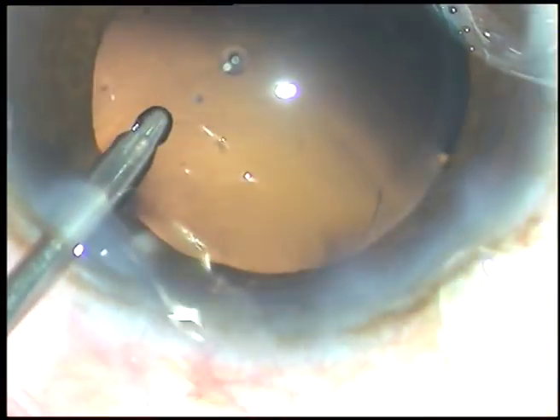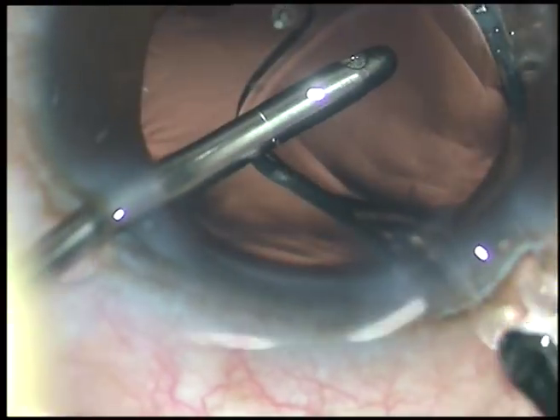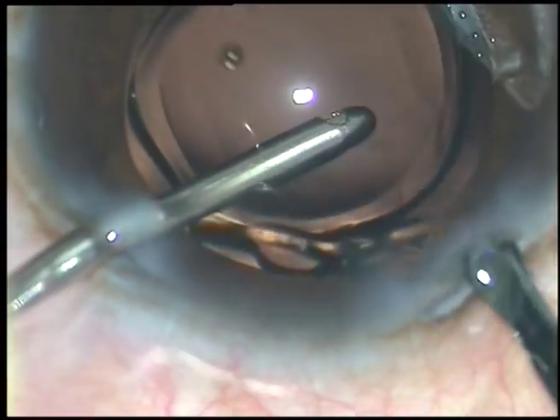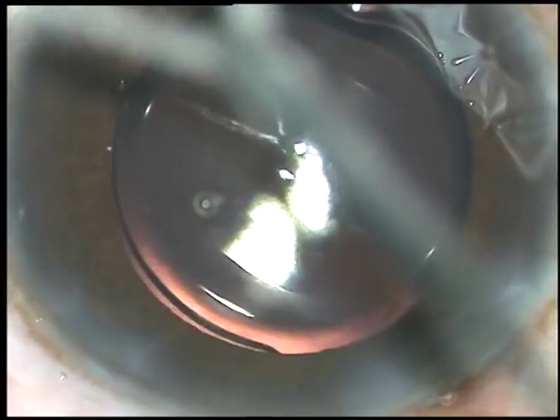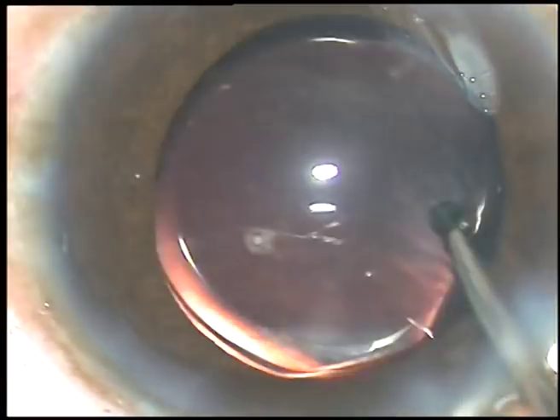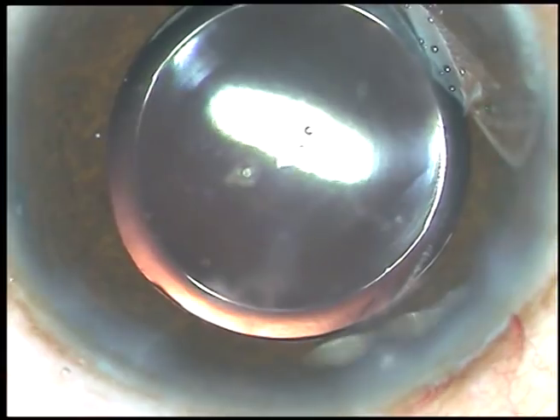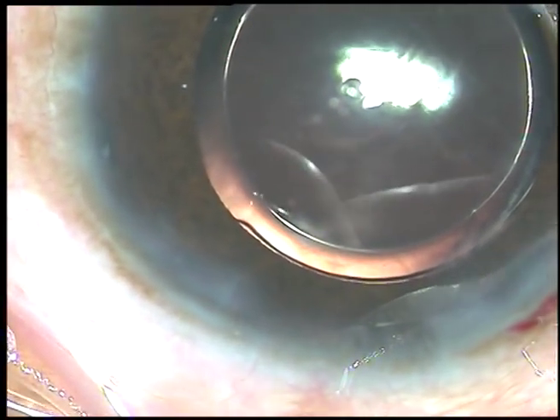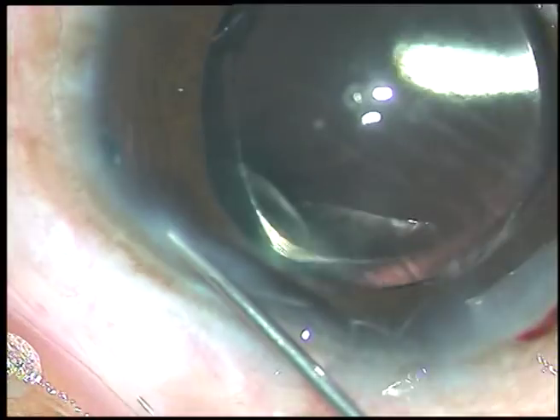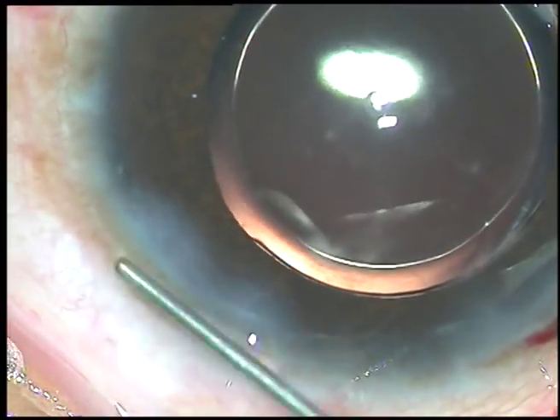Now a hydrophilic acrylic intraocular lens is being implanted in the capsular bag. The lens has gone into the capsular bag and is dialed by the irrigating probe itself. The advantage is that the anterior chamber is formed and any viscoelastic remaining in the lumen of the cartridge comes out.